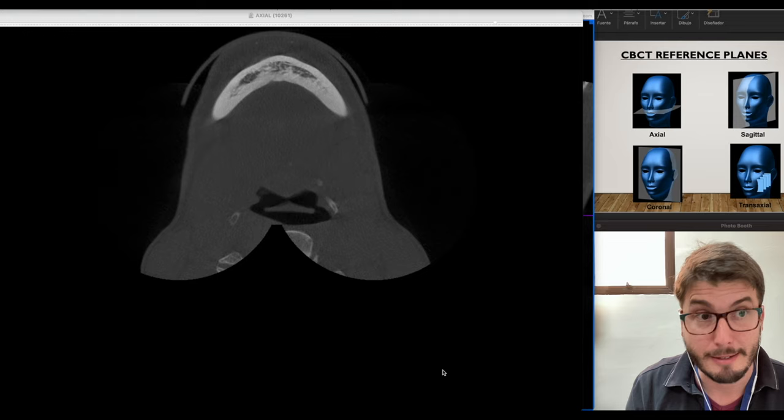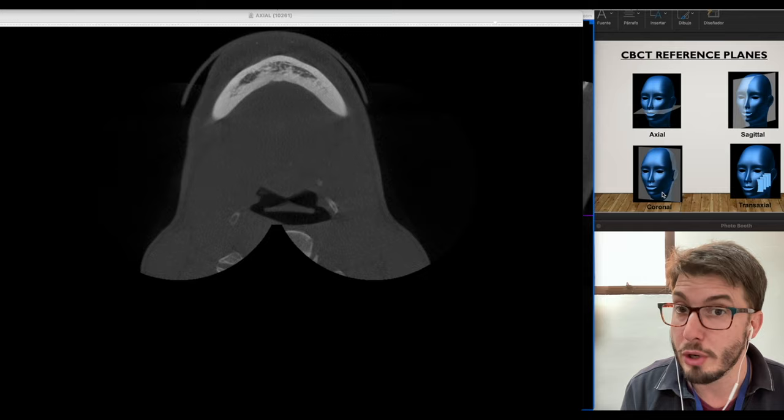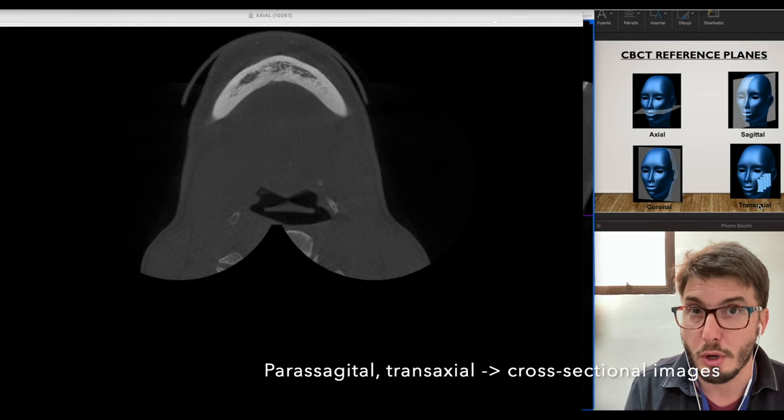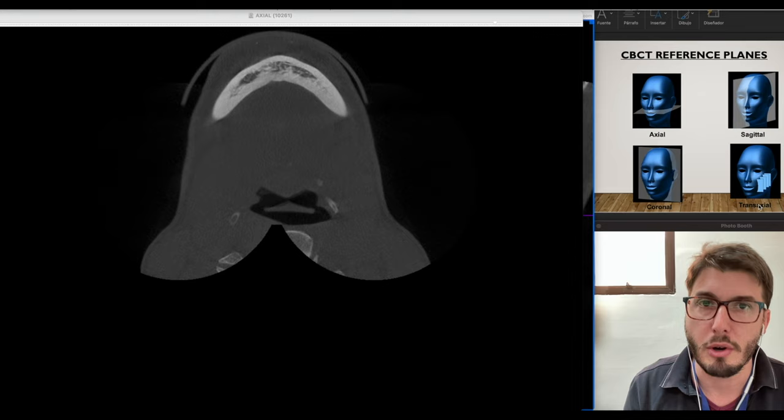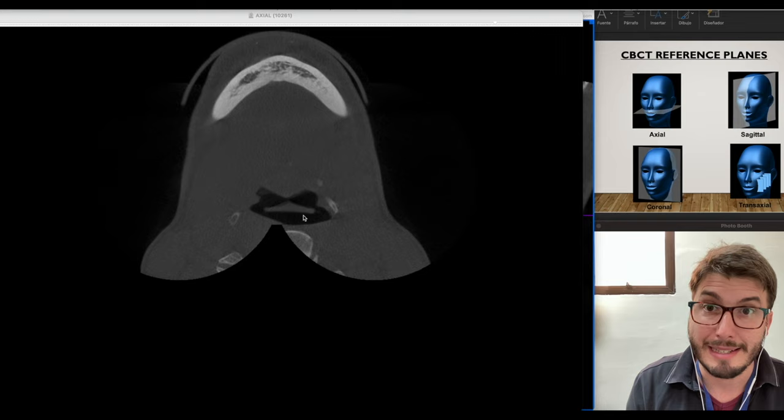Here we have the CBCT reference planes: axial, sagittal, and coronal — the three orthogonal planes — and then the transaxial parasagittal, which is also one of the most common names in scientific articles. You can also call these cross-sectional images of the alveolar ridge, as they are true cross-sectional images of the dental arch. Without further ado, let's start analyzing the axial images.